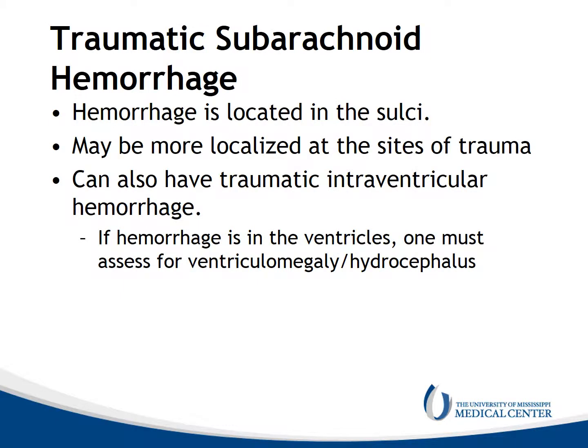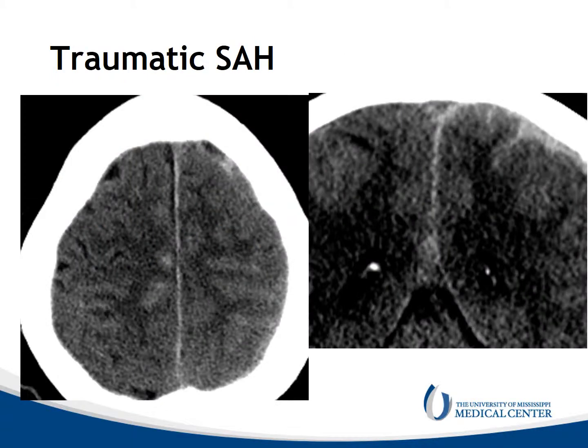Traumatic subarachnoid hemorrhage also occurs. Hemorrhage is located in the sulci and may be more localized to the sites of trauma. You can also get traumatic intraventricular hemorrhage, and any time you have intraventricular hemorrhage, one must assess the ventricles for ventriculomegaly and hydrocephalus, which needs to be addressed. Here's traumatic subarachnoid hemorrhage — we can see in the sulci, particularly in the right frontal lobe, areas of hemorrhage extending into the sulci. There's also a small subdural in the left hemisphere.